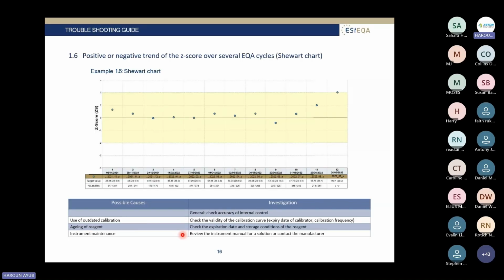Inaccurate volumes of reagents can also be a factor. So if you're using the reagent that is at the bottom of the bottle, depending on your machine, how does it handle carryover and so on, you might have issues of the reagent being diluted with particles. If you don't cover your analyzer, remember, dust is in the air. So dust will be able to settle in your reagents. And as dust settles inside, depending on which environment you are in, it will affect the results.